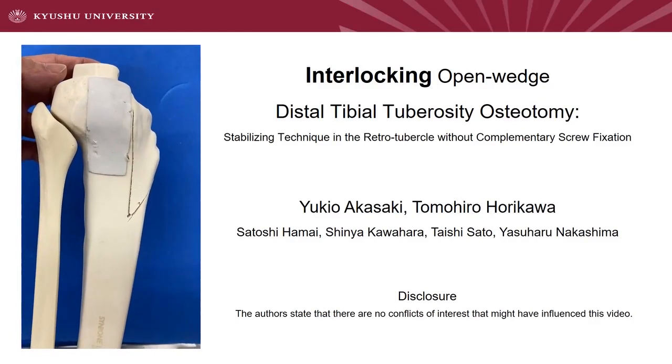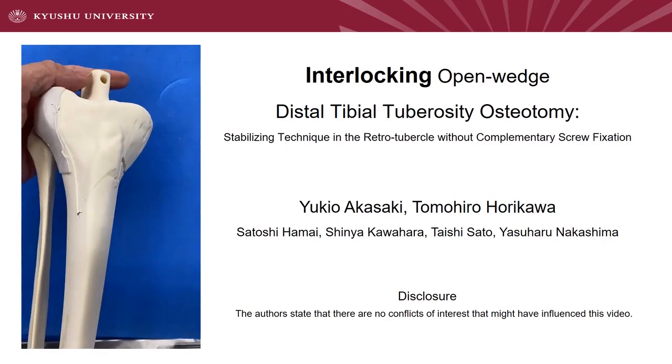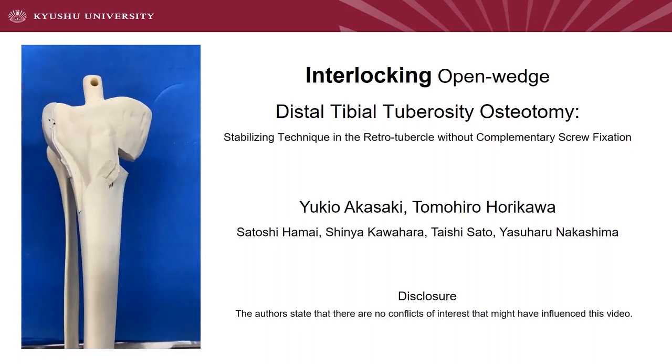Interlocking open wedge distal tibial tuberosity osteotomy. Stabilizing technique in the retrotubercle without complementary screw fixation.